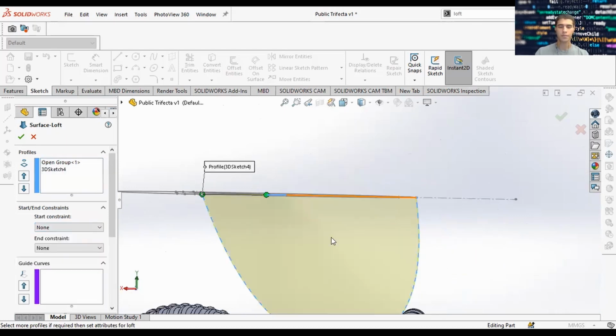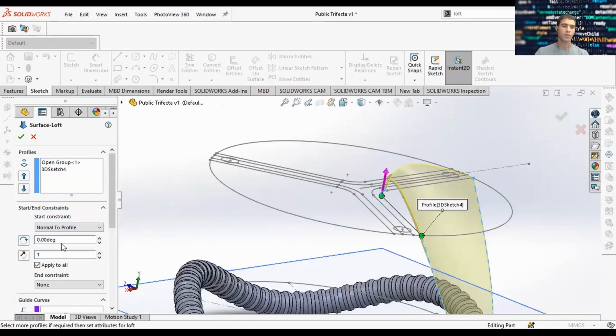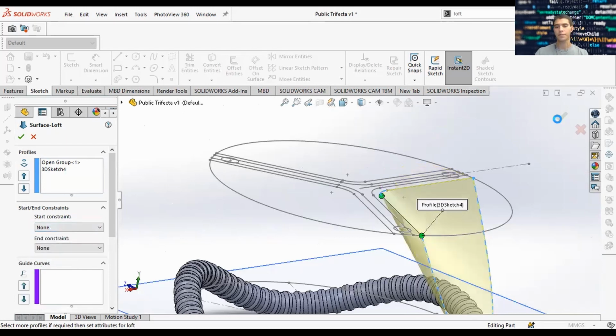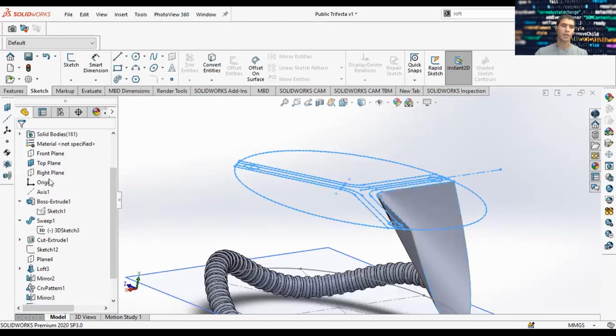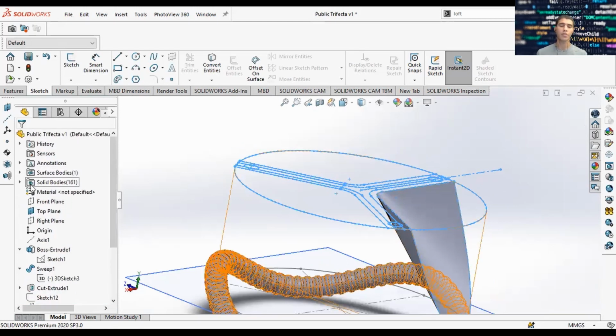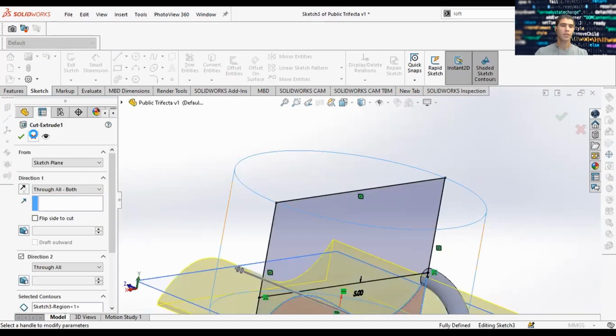Let's add some constraints. Sometimes the constraints won't help you as much. So let's just leave it none. Let's bring back our bodies. And so now you'll notice we have a solid body category and a surface body. The surface body was the surface loft we just made. And so we just played in SolidWorks and made a surface body. And there's other ways you can manipulate surface bodies into being solid bodies, which I will show you one way here.